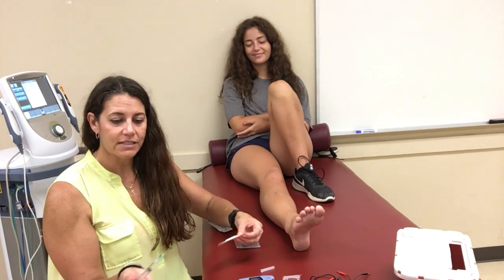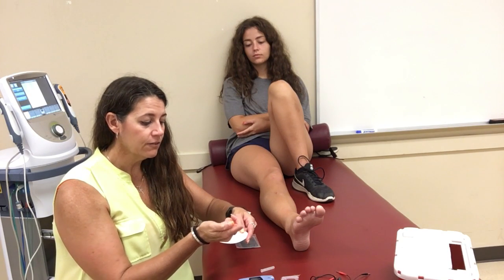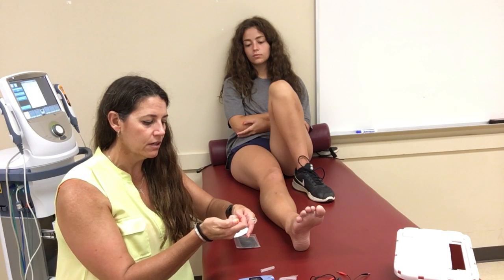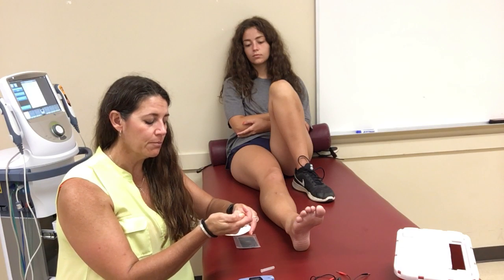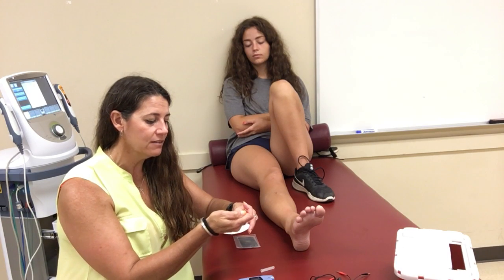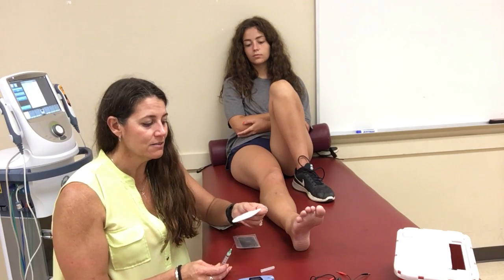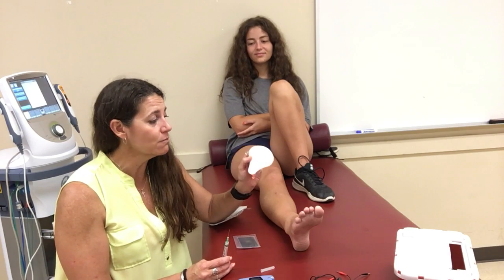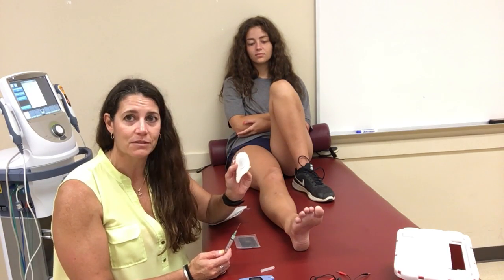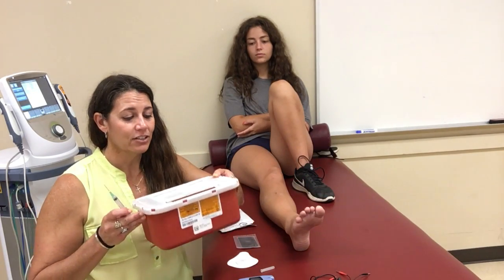Take the medication and soak the pad with it. If you don't have enough medication to fully soak the pad, you need to get more. The pad should be correctly sized to the treatment area. In this class we only have one size, but in reality the smaller the treatment area, the smaller the pad should be. These are medium-sized pads.